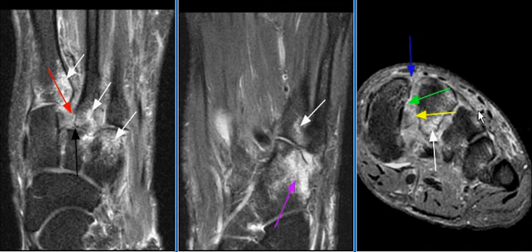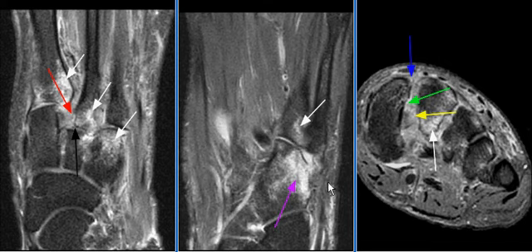Osseous edema is seen at the base of the metatarsals and distal margin of the cuneiform bones, coupled with trabecular microfractures. A subchondral plate fracture is seen at the distal cuboid bone with reactive edema.